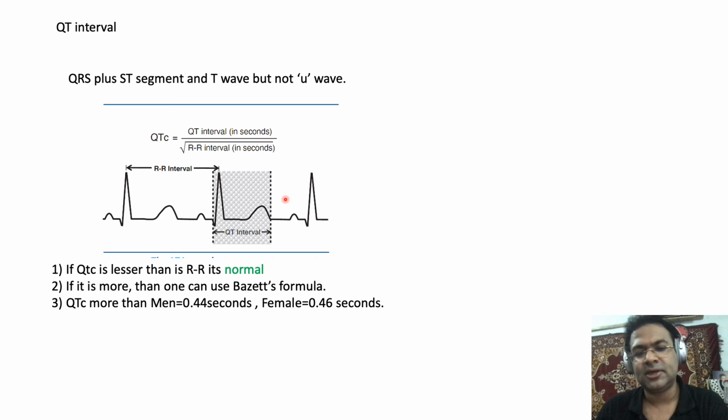If there is an abnormal external stimulus on the T wave, it can cause a dangerous arrhythmia and kill the patient. Therefore, when QT prolongs, the tendency of this arrhythmia increases, and when QT prolongation leads to some kind of arrhythmia, any kind of impulse falling on the T wave leads to polymorphic QRS morphology, meaning changing in axis as well as morphology. It's a very dangerous ventricular tachycardia which can kill the patients. So you have to be very careful in QT prolongation.